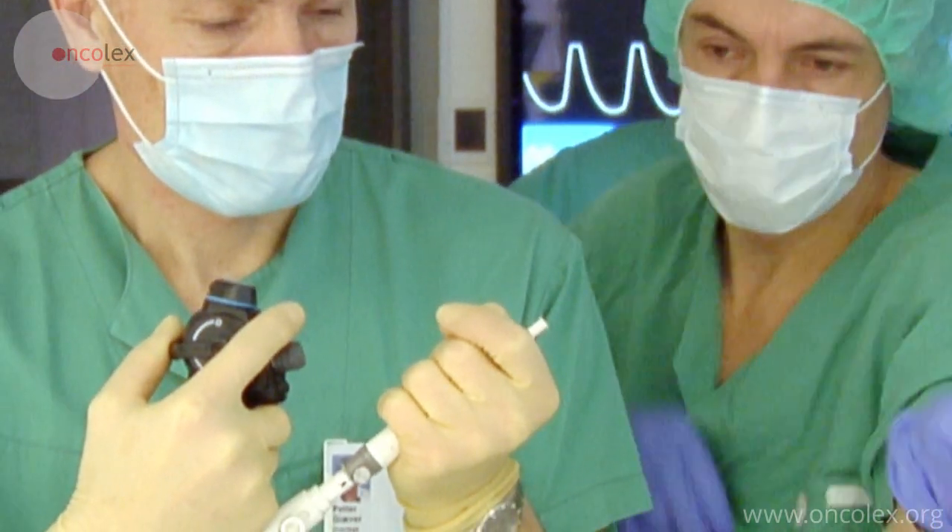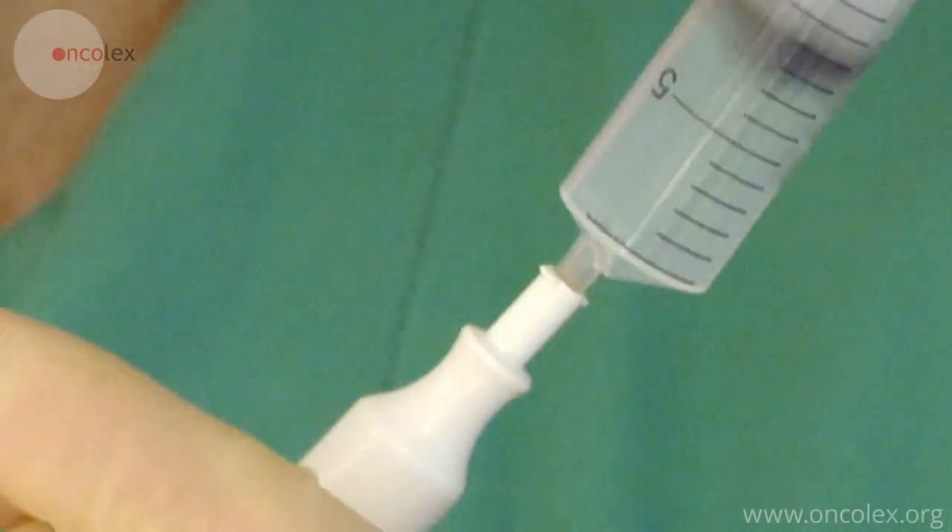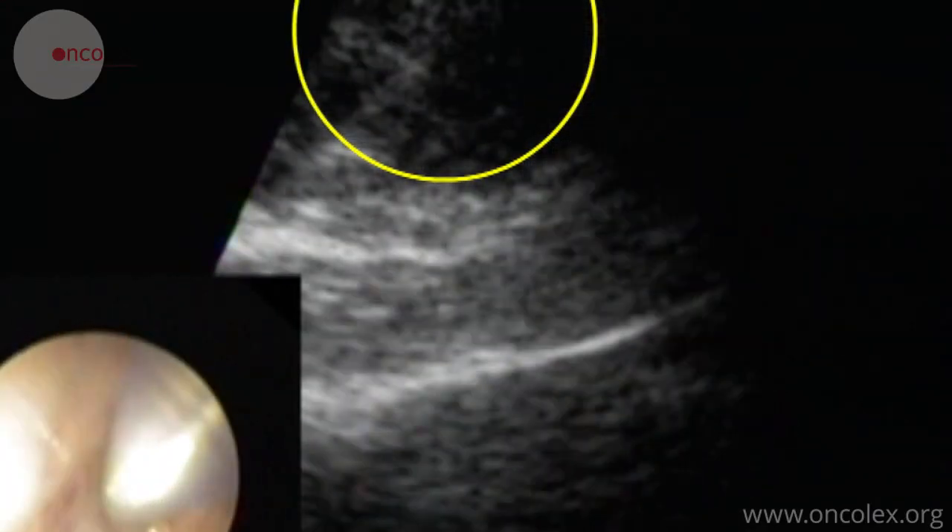The introducer is removed from the needle. Using a syringe, the operator aspirates while simultaneously moving the needle back and forth in the lymph node.